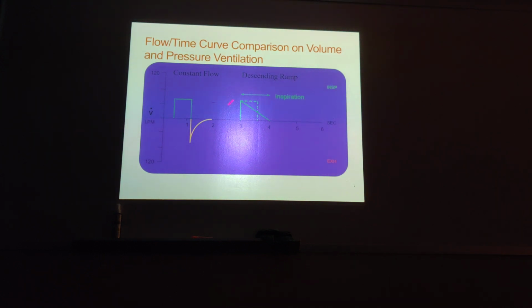Okay. So this is what is good. This is what is the best. It doesn't create a whole lot of PIP. Therefore, the risk of barotrauma is very low. It promotes a distribution of gas all over the lung field.